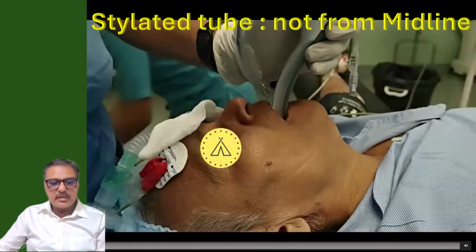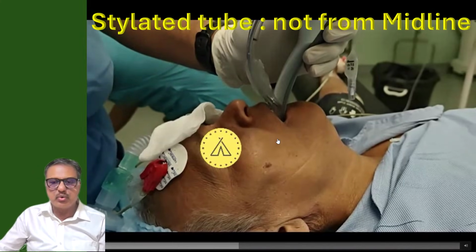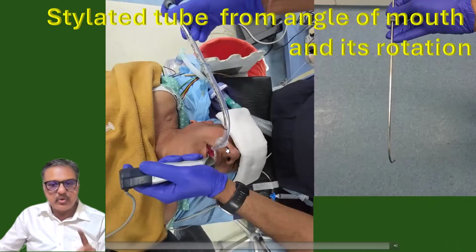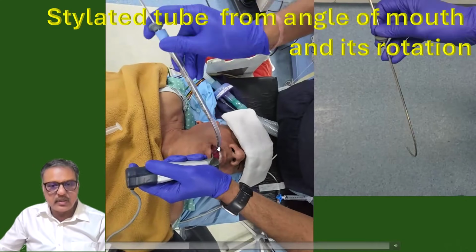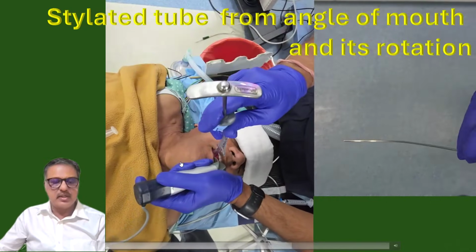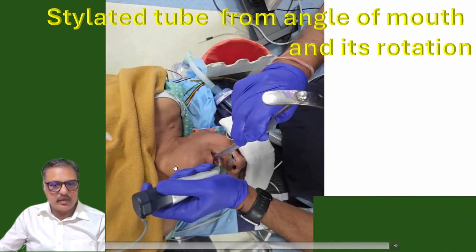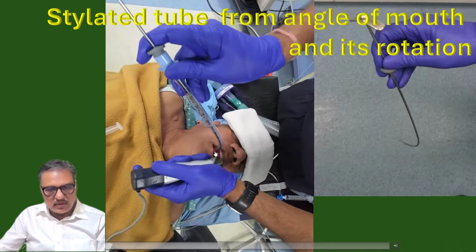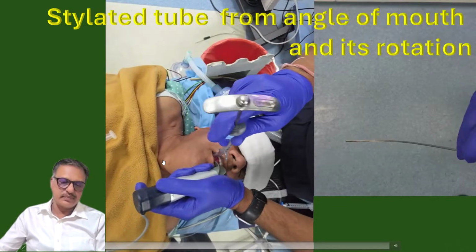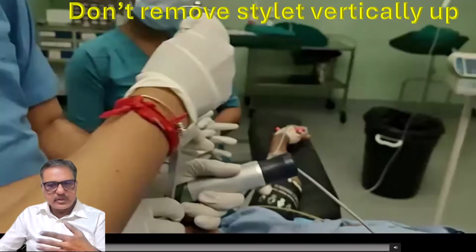And when you are inserting the styletted tube, don't insert it in the midline because you won't get the space to go in. So the preshaped endotracheal tube during hyperangulated videolaryngoscopy has to be inserted from the angle of the mouth and rotated towards the larynx. So the tip of the tube is going to align with the laryngeal inlet. I am showing it again. It has to be inserted from the side of the mouth and then rotated towards the larynx. Now you reach up to the larynx.